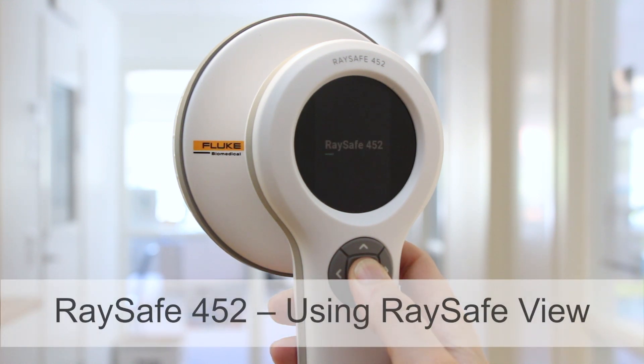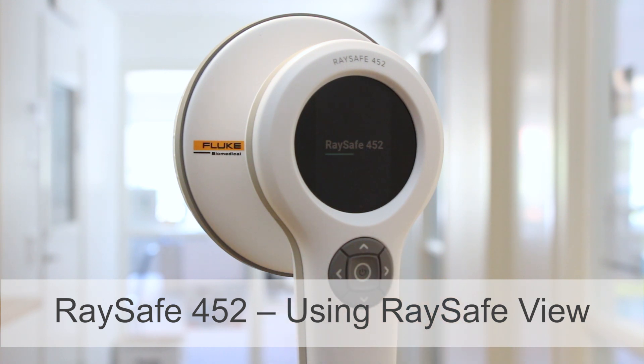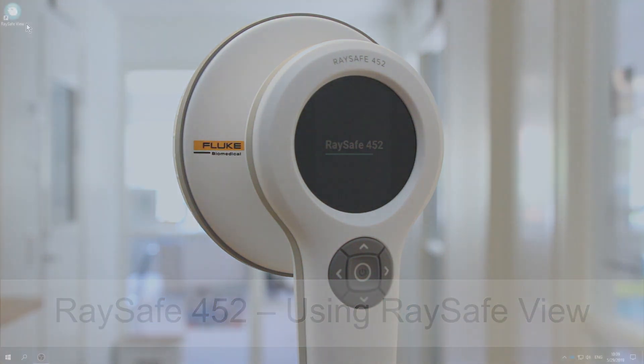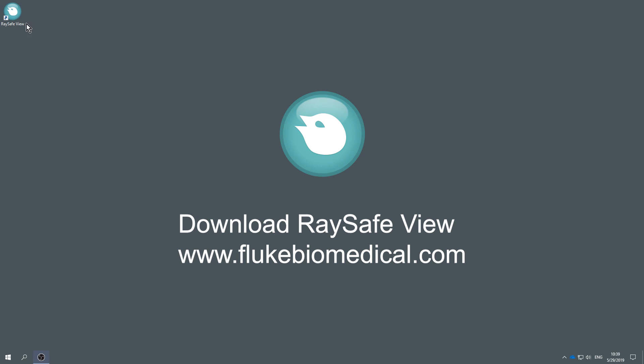I want to show you how to use RaySafe View with the RaySafe 452. RaySafe View is a PC software. Download and install it on your PC.